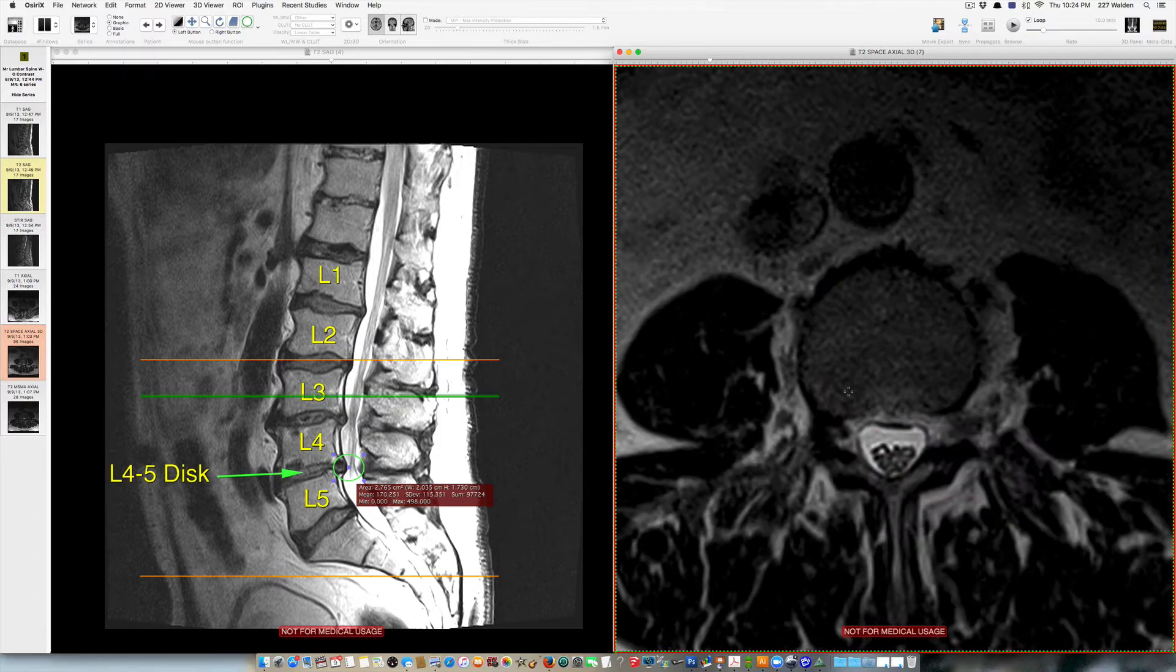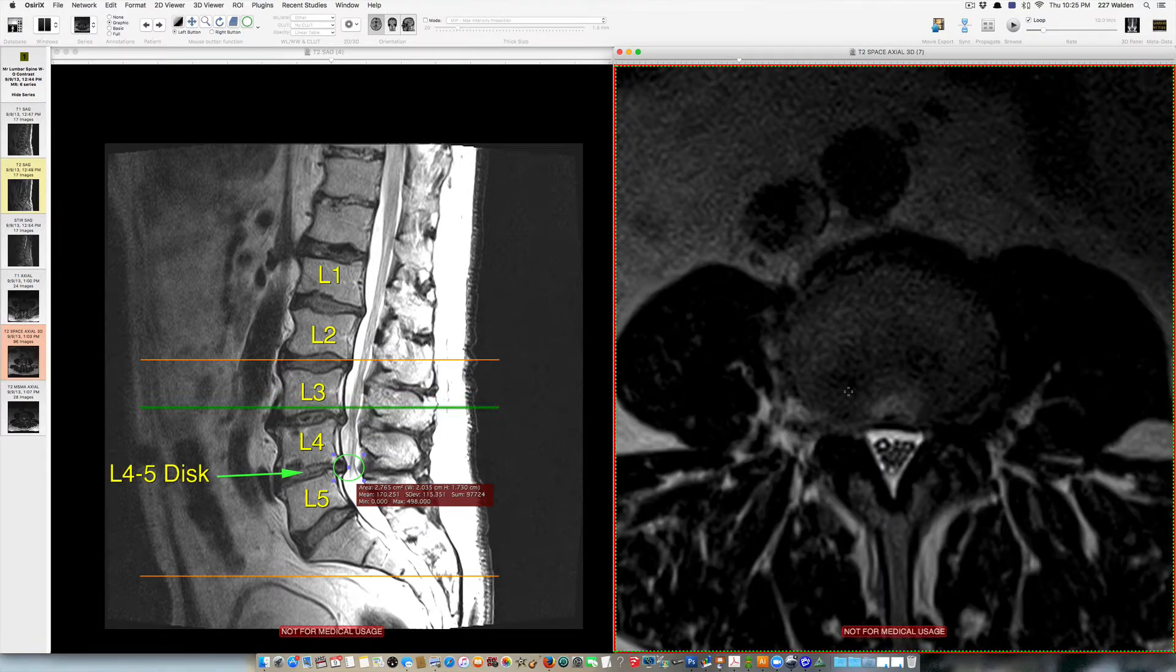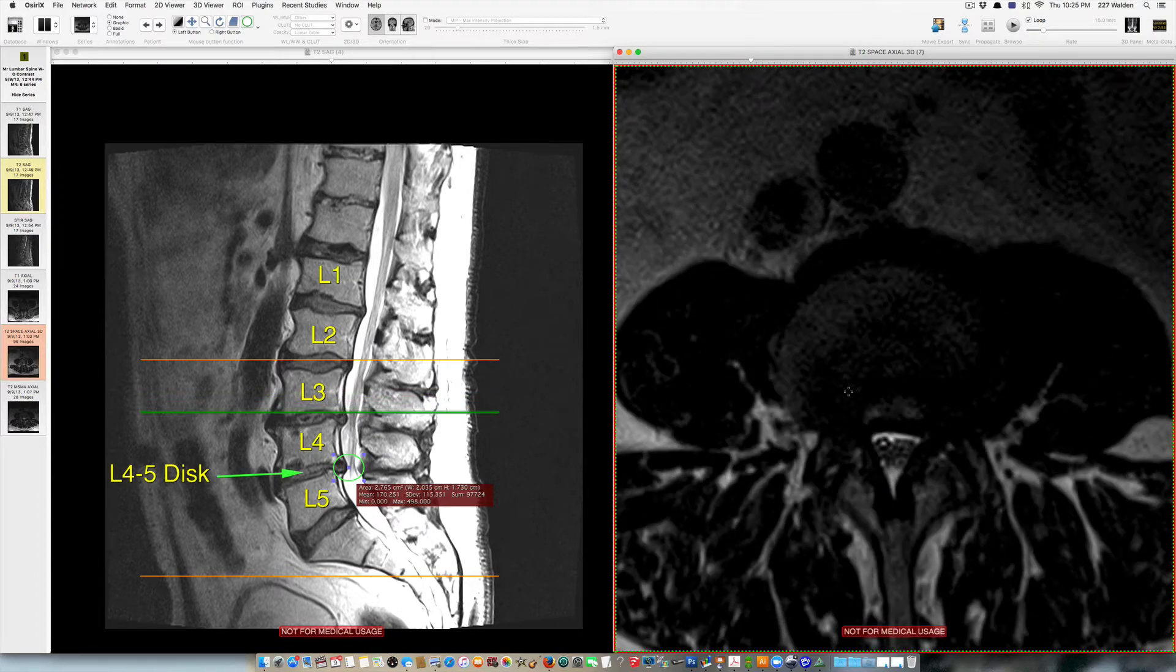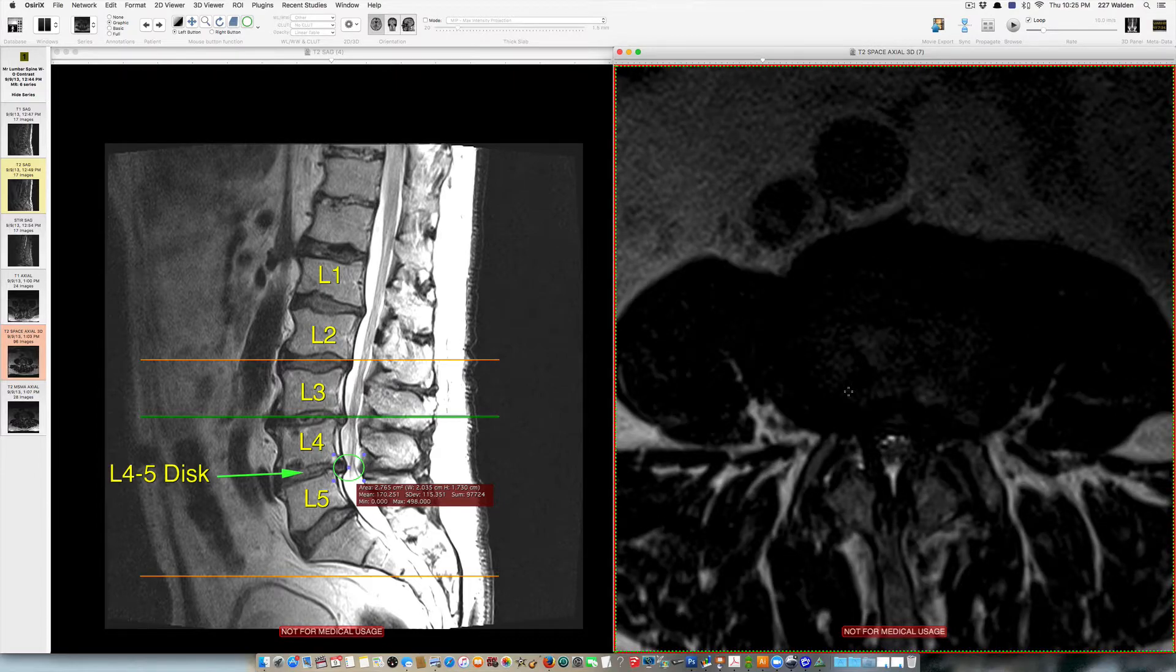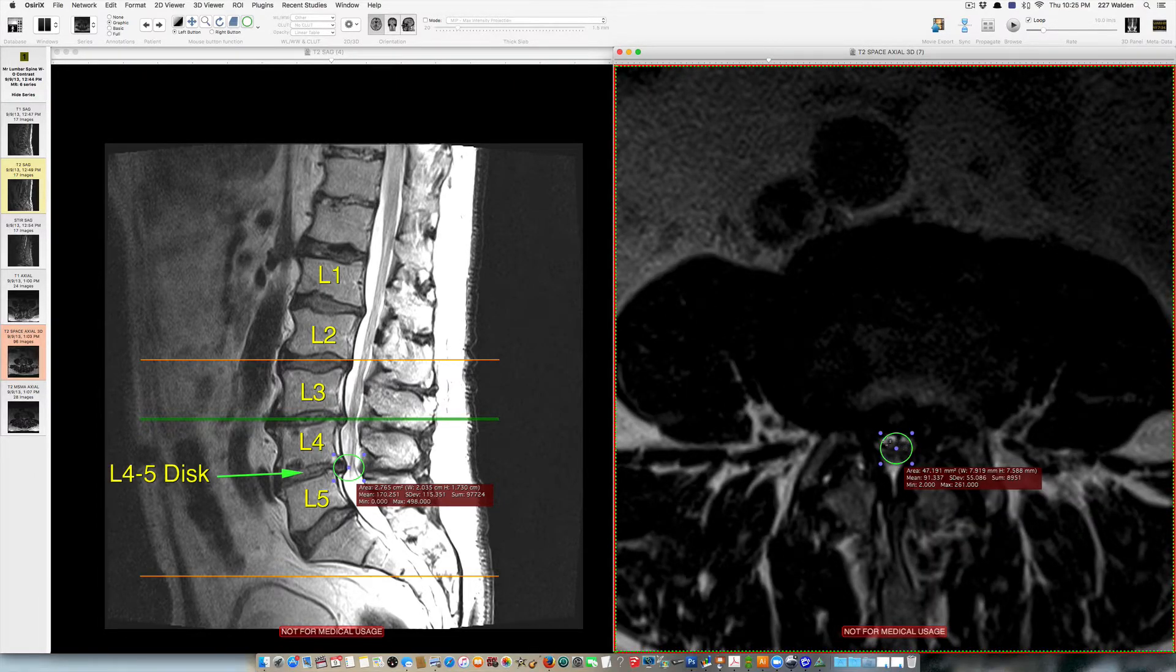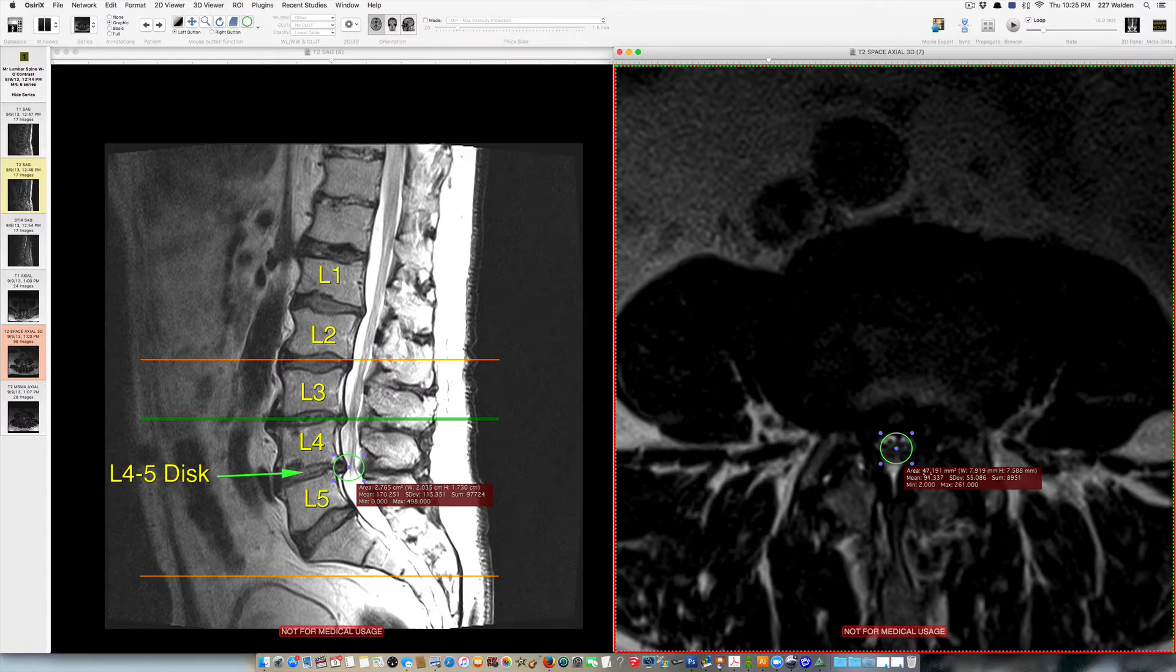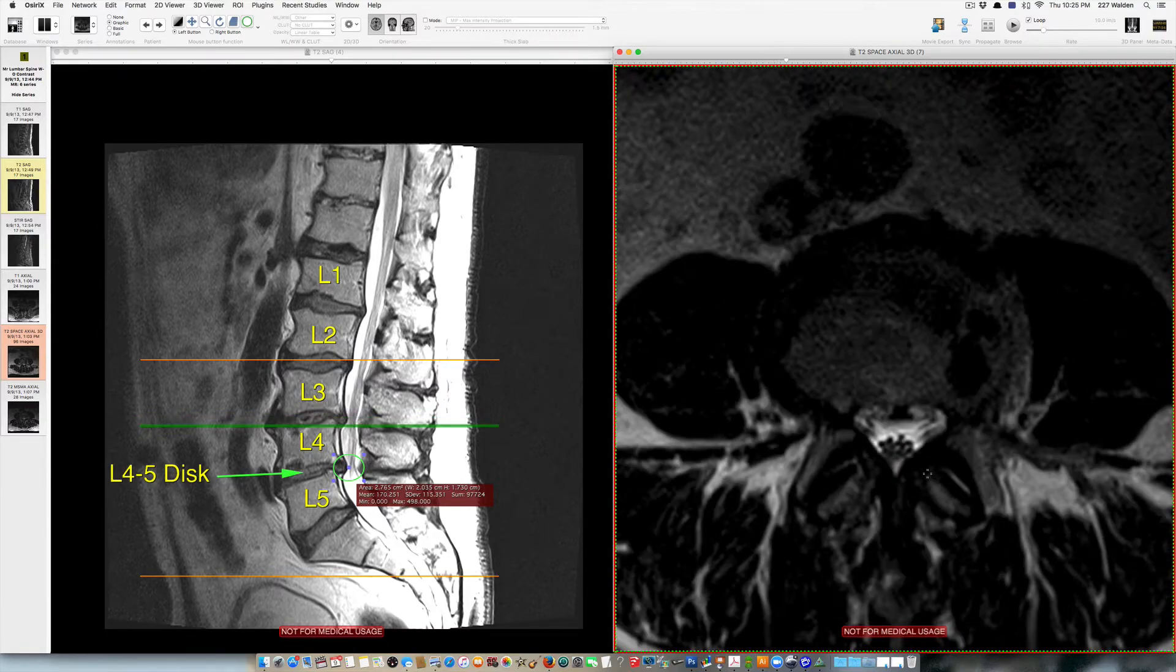As I scroll down through the spine here and we get to the L3-L4 level you can see that at this level the spine has gotten very tight and there's very little space available for the nerve roots. And here the area has decreased to 0.47 centimeters, so about a third of the size of normal.